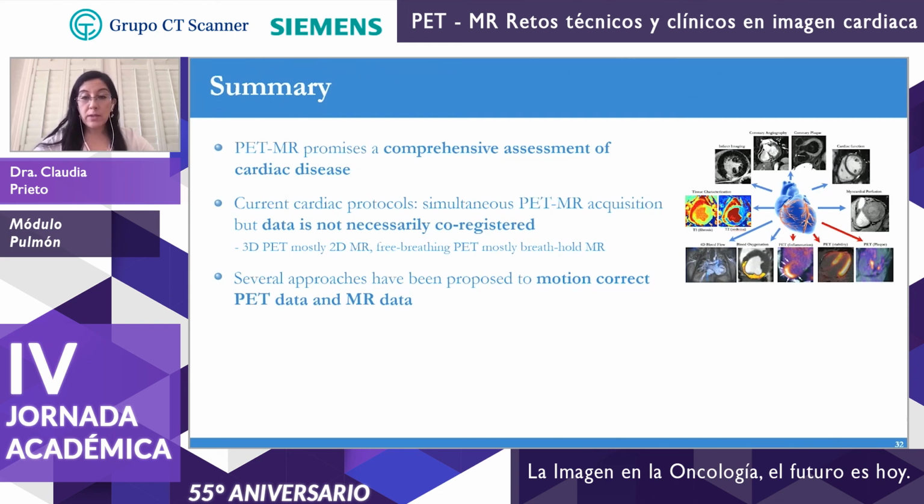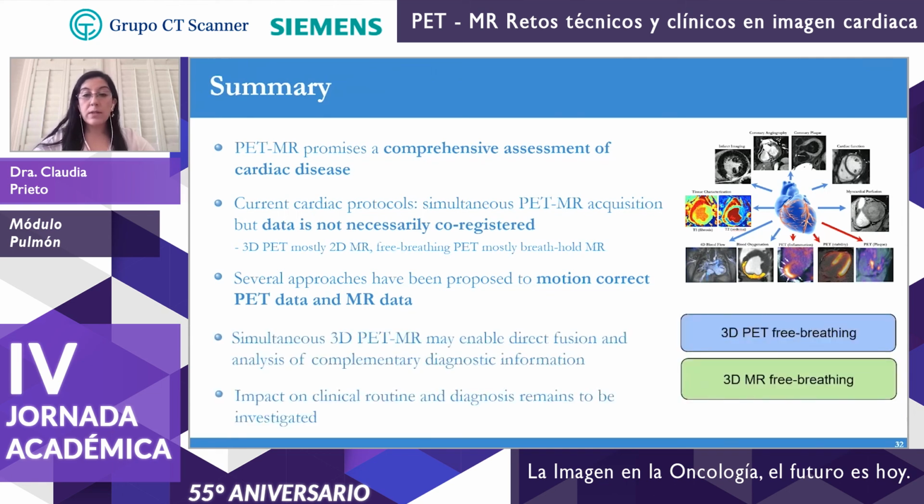So several approaches have been proposed to overcome these challenges, allowing motion correction for both the PET and the MR data. However, despite these promises, the impact of these new PET-MR methods on clinical routine and diagnosis remains to be investigated.